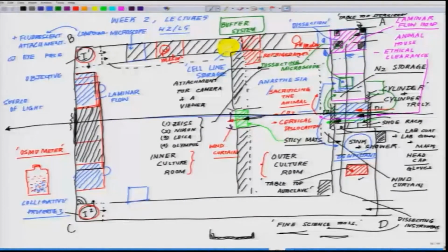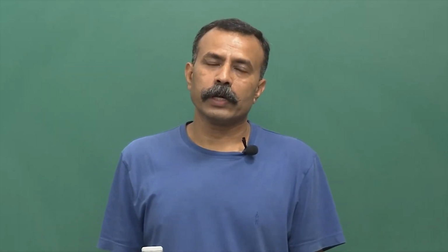An osmometer works using a freezing point depression process. Again, I am not going to get into that because it falls under the study of colligative properties.